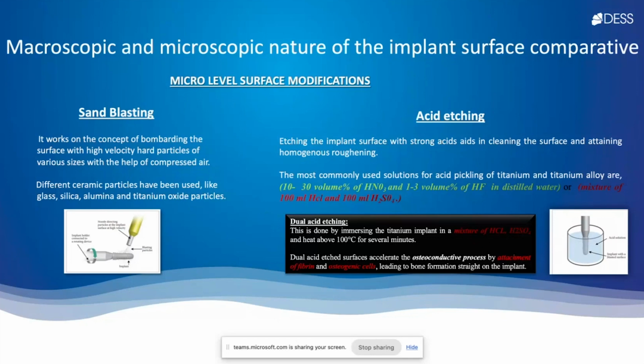So when you treat your implant surface and make it ready to attract the cells and the fibrin, you achieve faster osseointegration. A lot of companies have made a lot of techniques for surface treatments, and I'm going to go through a little bit about these surface treatments.